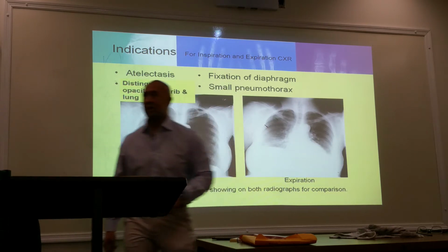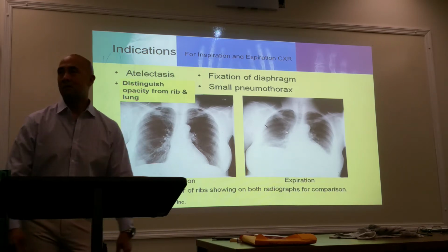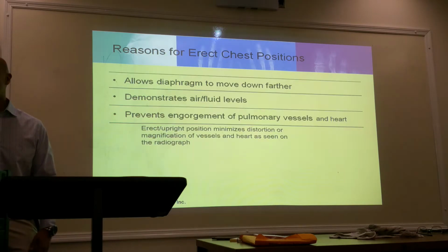And it's harder to see on these x-rays here, and I don't know why they use this as an example, but you're missing some lung markings over here that may be an indication of a collapsed lung. But it's a bad x-ray. Now, possible fluids here, there is some flattening out over here. There's definitely some flattening out over here, so this is fluid in the lungs right here. The more you see, the more you will understand.